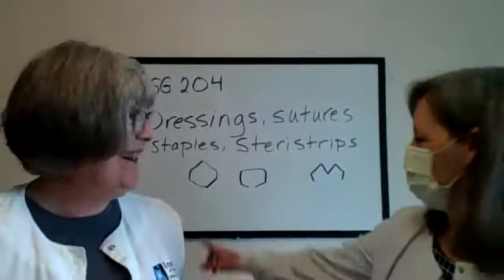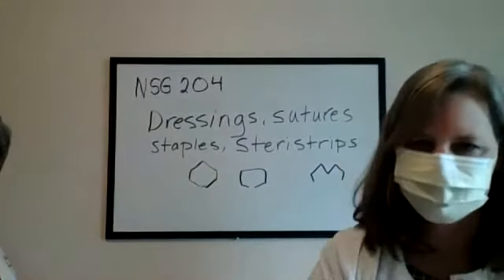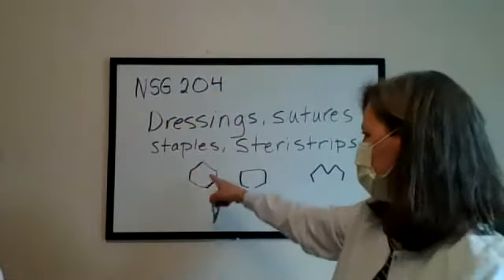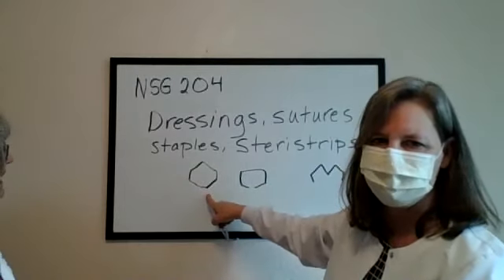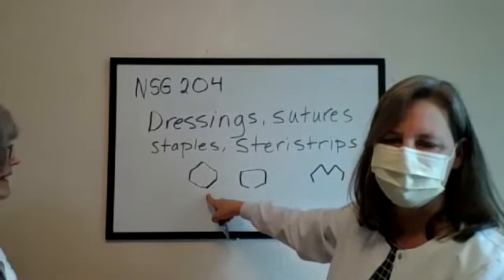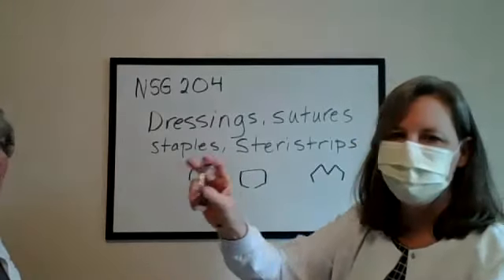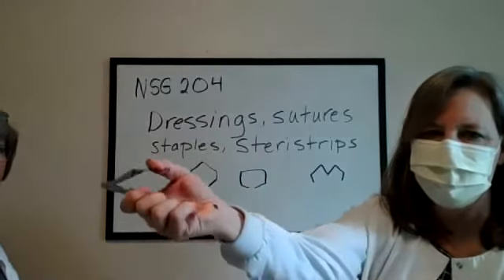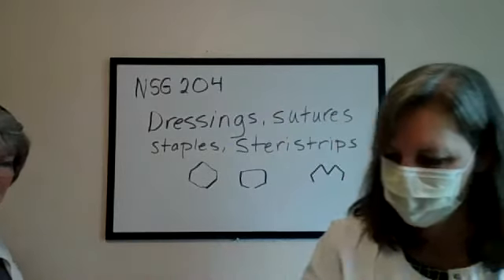And this other form, this is to tell you if you do this upside down like this, what you can do is make that staple go deeper into the skin and very, very difficult to get out. So always one on top, one on top, and it has a great little handle sometimes. Just make sure one on top, okay?